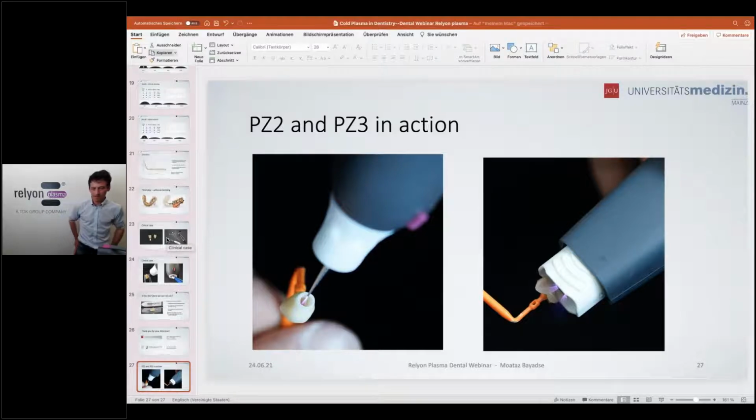Okay, thank you very much. So the effect on zirconia is quite the same. The surface recovery effects are also the same, so the timing behavior of the recovery is quite similar. This is what we have also checked in our experiments.